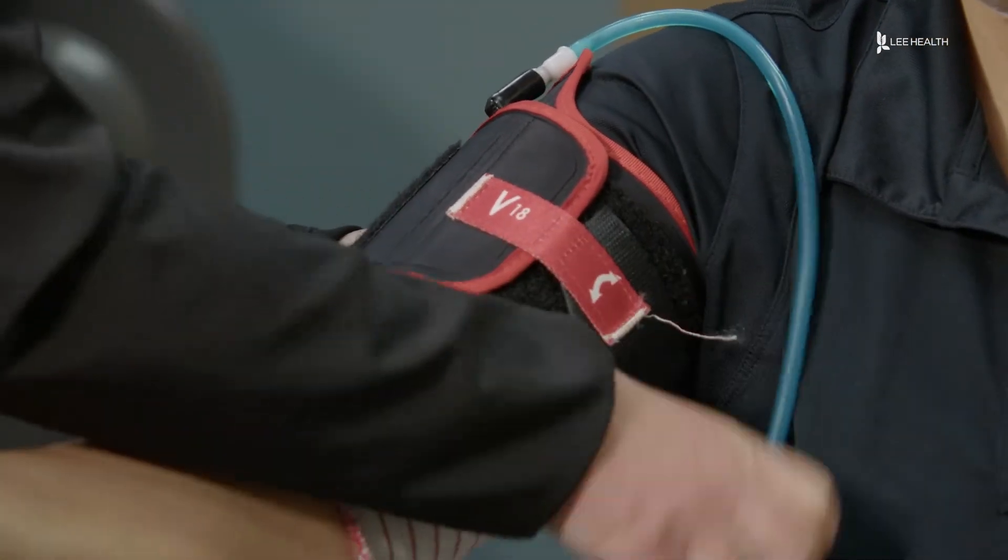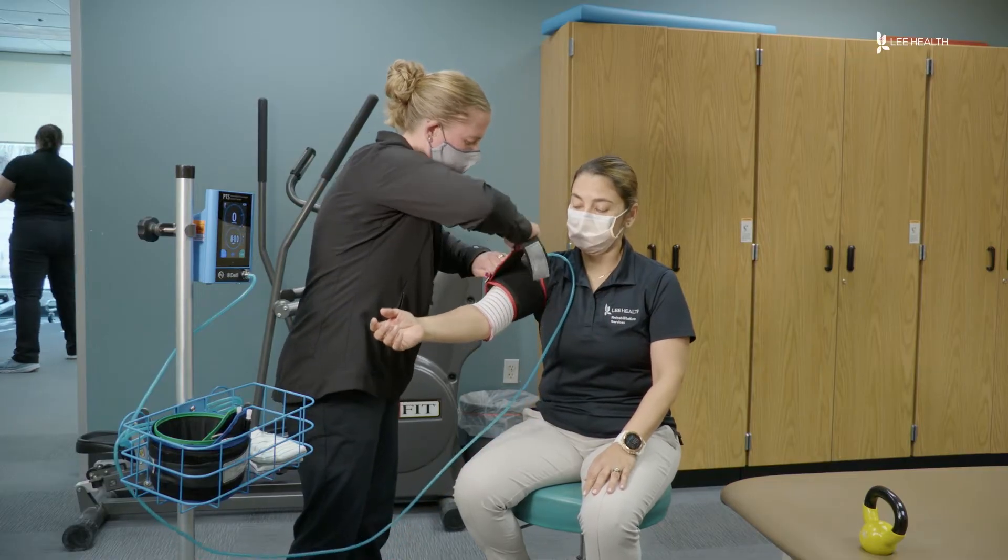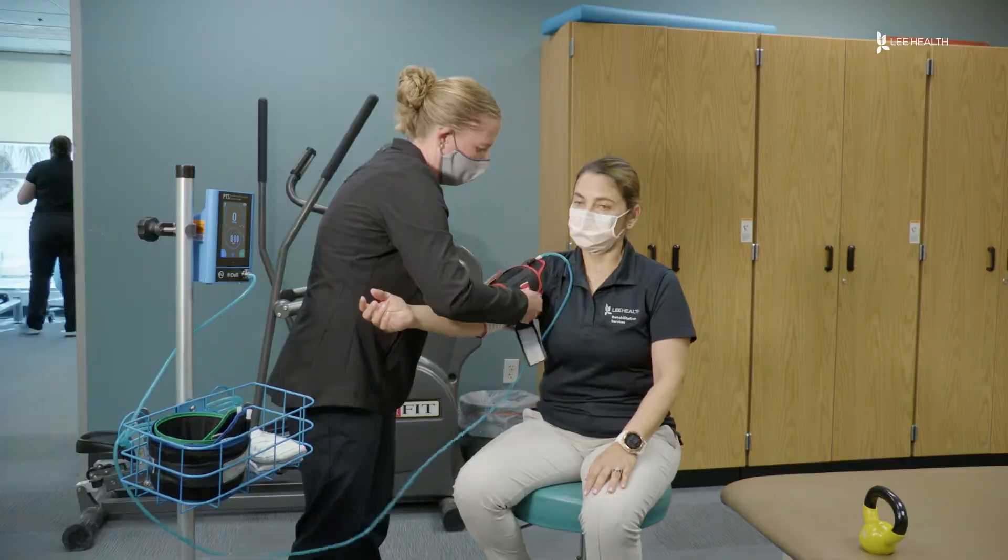This is the blood flow restriction machine. Pro athletes use it all the time just for strength gains and recovery. It helps people build muscle quicker. Instead of waiting 6 to 12 weeks to gain strength, this decreases the time to 3 to 4 weeks where we start to see the strength gain.